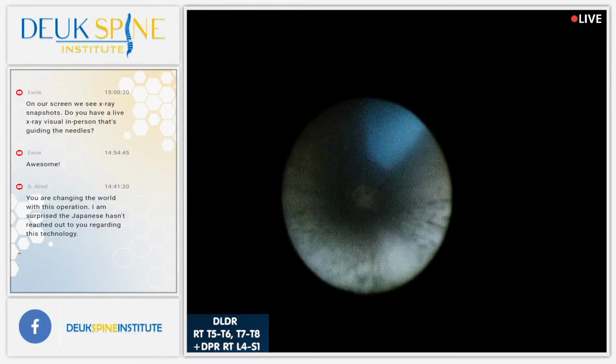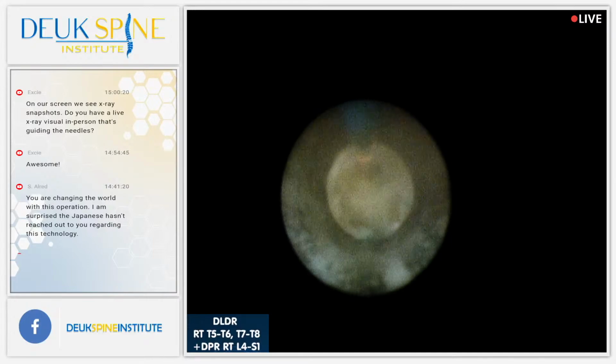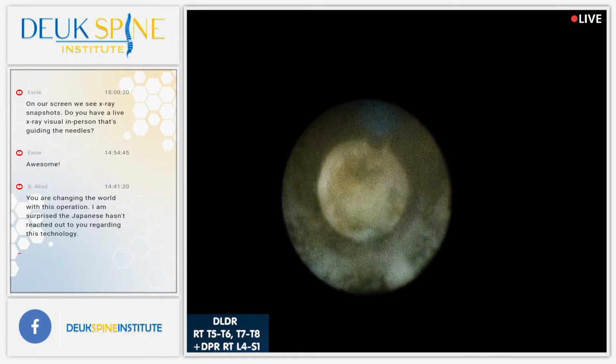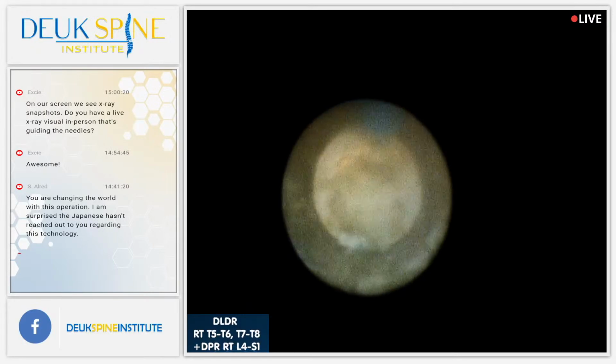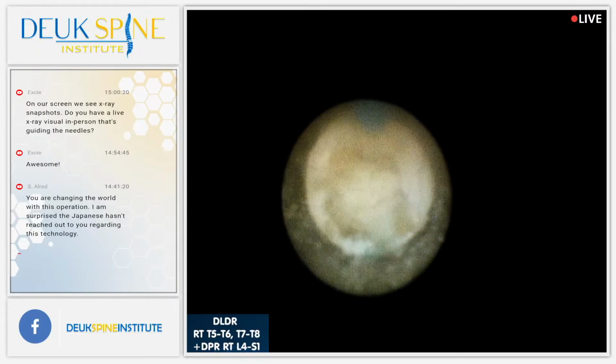I could do it, but it would be exposing the patient to unnecessary radiation. We do have a cine mode on this fluoro, which allows us to hold the button down and keep continuously taking pictures, but the amount of radiation released is massive compared to a still shot.